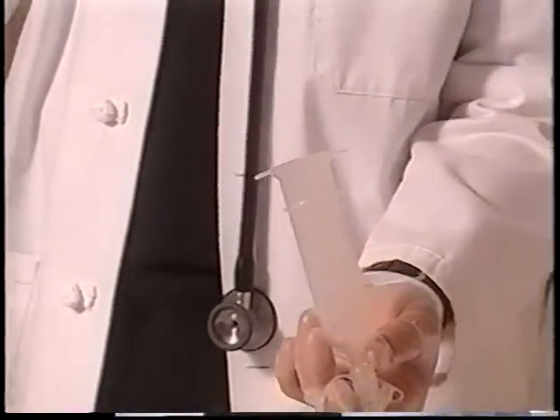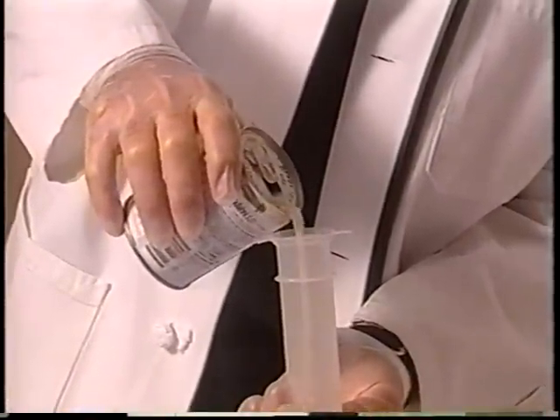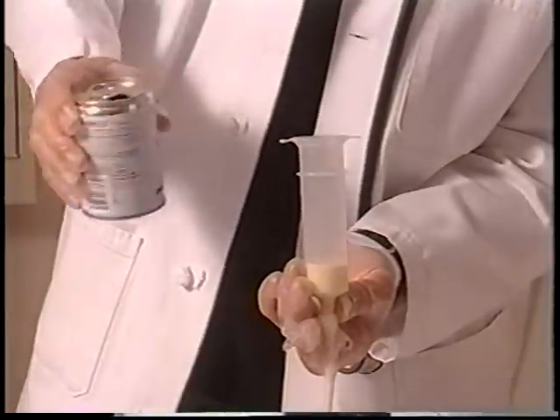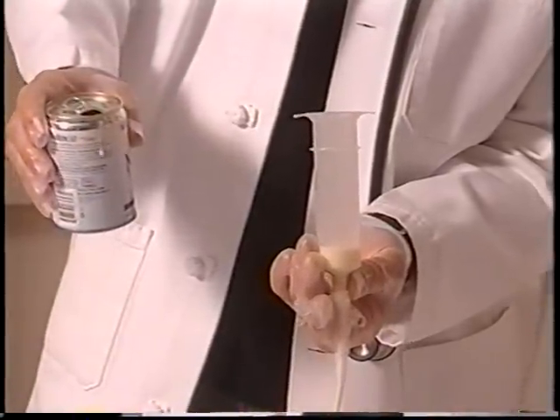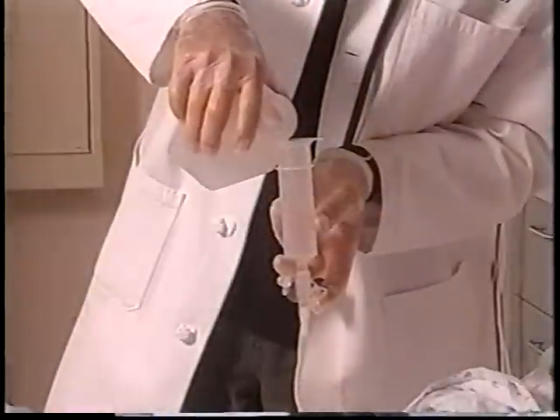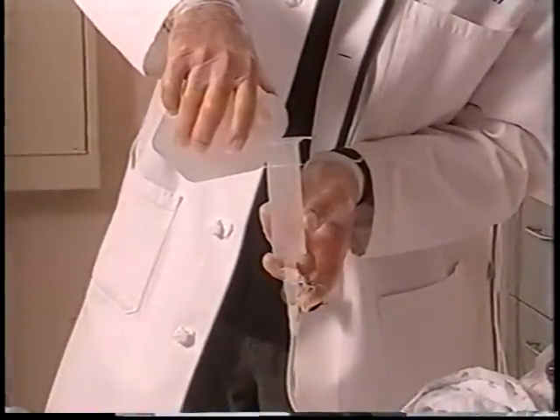If the patient has a standard PEG tube, a gravity feeding method may be used. The syringe is connected to the end of the tube and formula allowed to flow in by gravity. Adjusting the height of the syringe alters the rate of flow. After the feeding is complete, the tube is flushed with water to maintain patency.